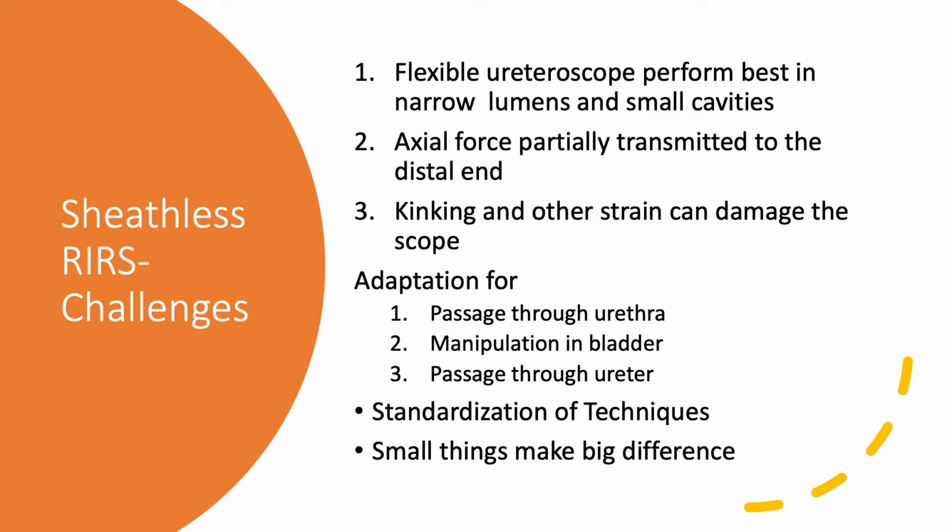To overcome these limitations and gain expertise in sheathless RIRS, we need to follow few simple steps. Expertise is nothing but standardization of fine details of a technique and meticulous execution with precision. Now we will go into the standardized steps of this technique, which is nothing but a mix of basic endourologic techniques. But I had to perform nearly 100 procedures before I settled down to the present sequence, which was again internally validated and finalized.